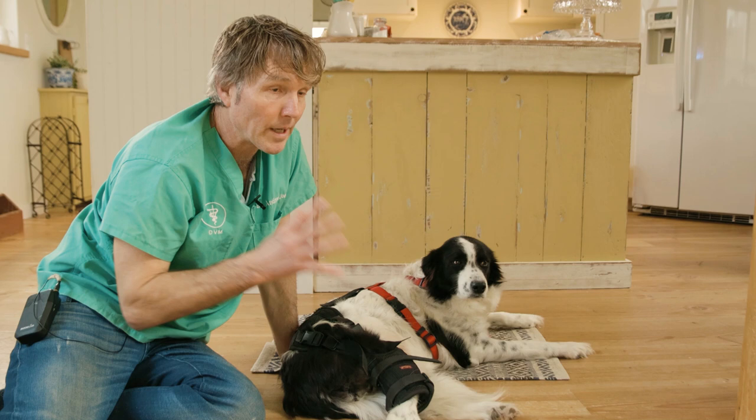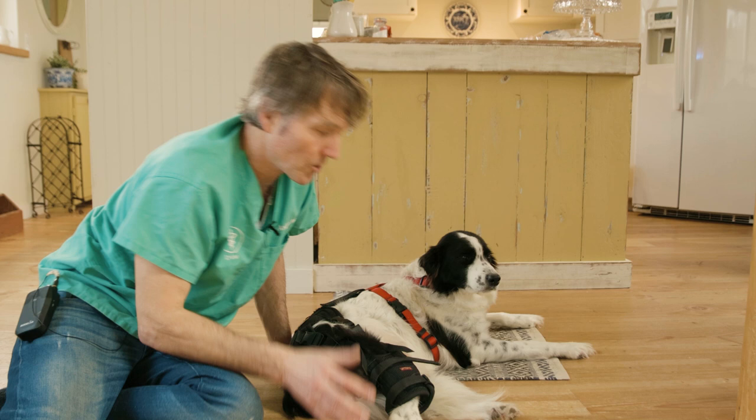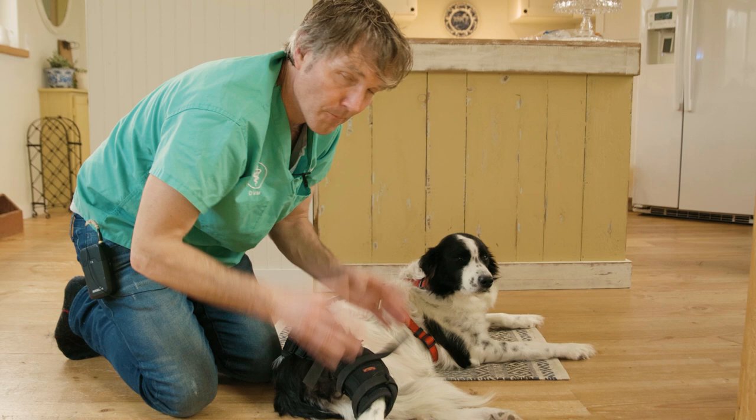This brace is working by doing a couple of key things. First, it provides rigid support around the injured knee — Heather cannot fully flex or fully extend the knee, providing stability by anchoring the femur and tibia so you don't get excess cranial motion, restraining that injured ligament. That's what injured her ligament in the first place — likely her foot was planted, the rest of her body went forward, and she tore that ACL.